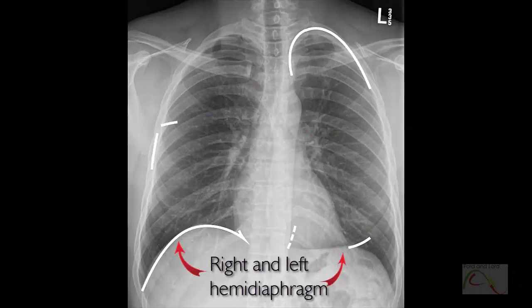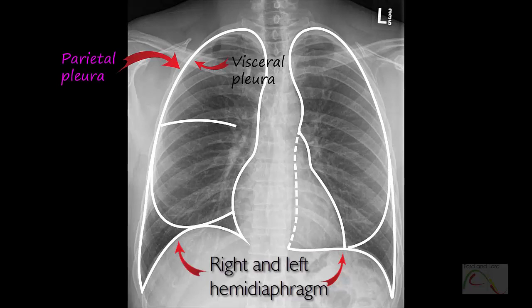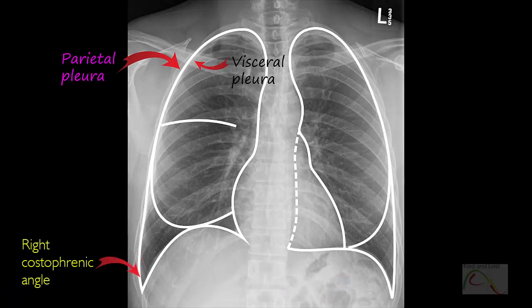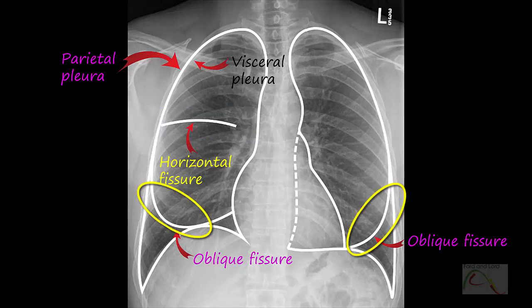The hemidiaphragms should normally have a smooth dome-shaped contour and should make sharp angles laterally, which are known as costophrenic angles. The angles medially are known as cardiodiaphragmatic angles. Pleural outlines are also drawn. This line represents the horizontal fissure, and there is also an oblique fissure. The right lung has three lobes and the left lung has only two. On a normal PA view, and rarely on lateral views, the horizontal fissure is visible as a thin line.